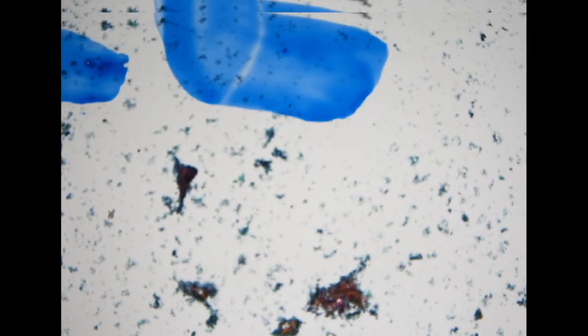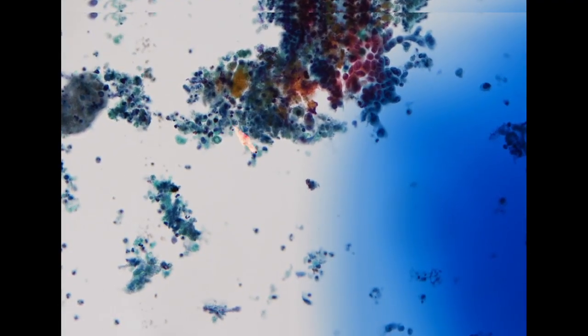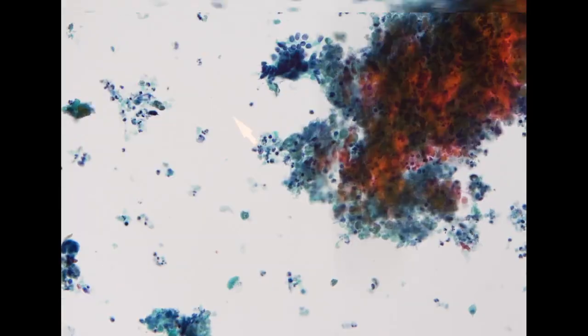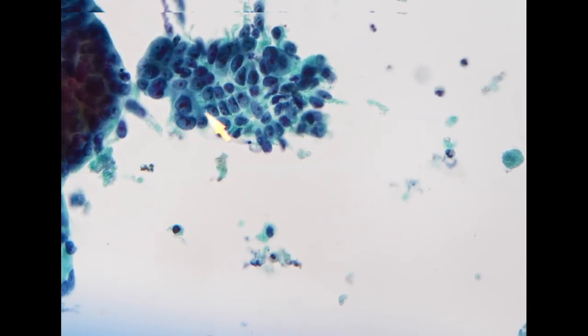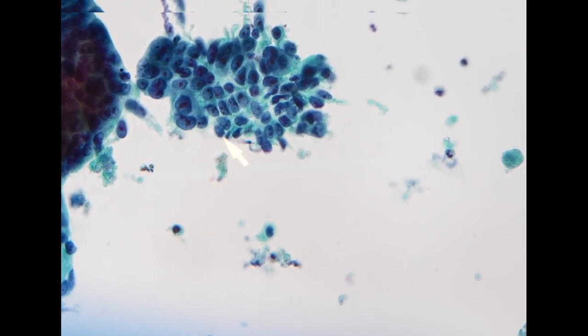So here is another EUS-guided aspiration specimen. Again, we see hypercellularity and it is quite busy in the background. There is a lot of prominent tumor necrosis, and the cells are hyperchromatic with features of adenocarcinoma. So this specimen is highly necrotic. But we do see some preserved tumor cells with irregular nuclear contour, variation in size, prominent nucleoli, and irregular arrangement. So this is positive for adenocarcinoma.